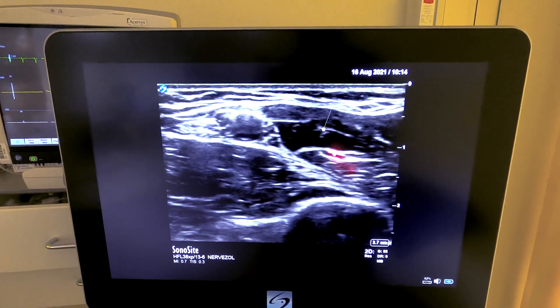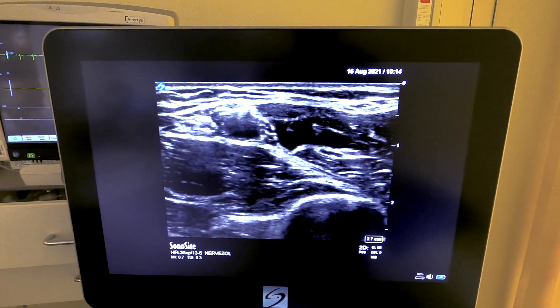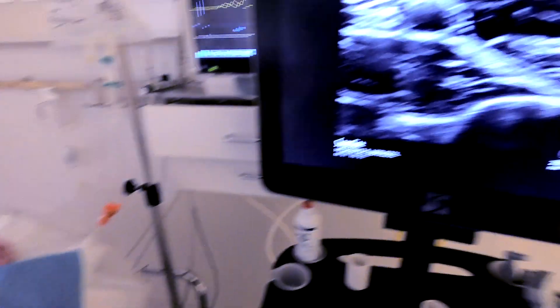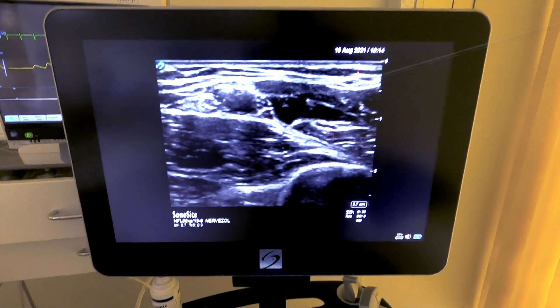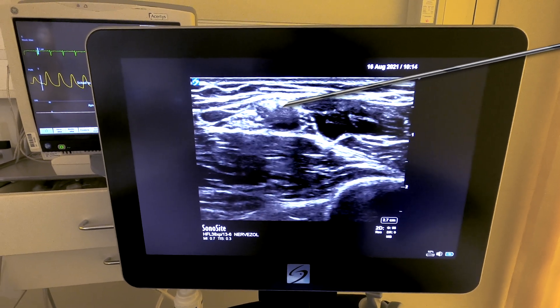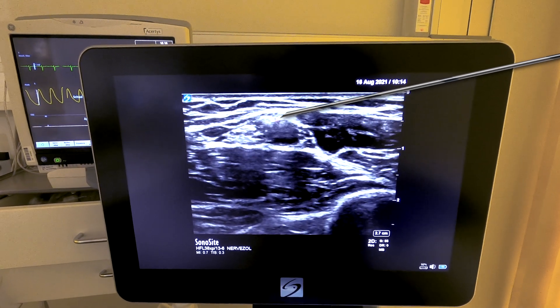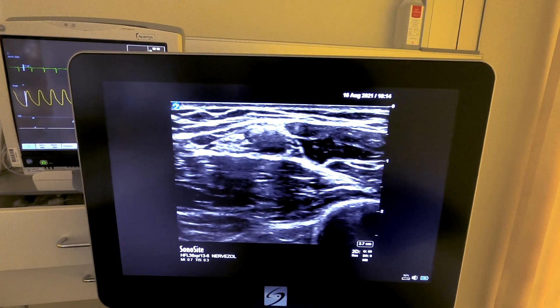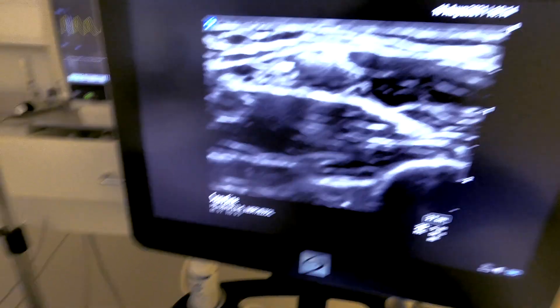The musculocutaneous nerve runs between the biceps and coracobrachialis muscle, and it's quite clear that we're going to need to block that separately. The block strategy will be to pass a needle using an in-plane technique just above the axillary artery, placing it at about the 11 or 12 o'clock position, inject 8 milliliters of local anesthetic, and then make decisions based on what spread we get.